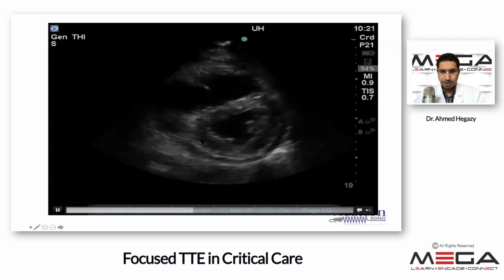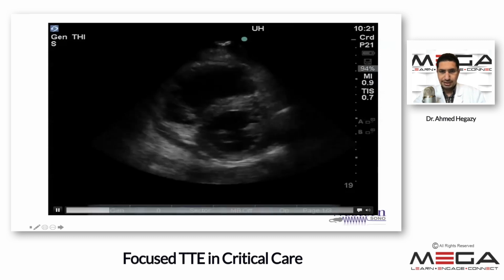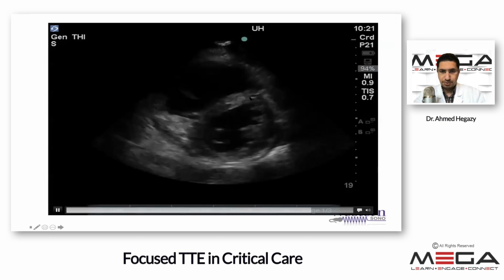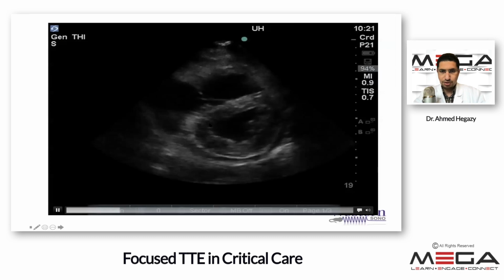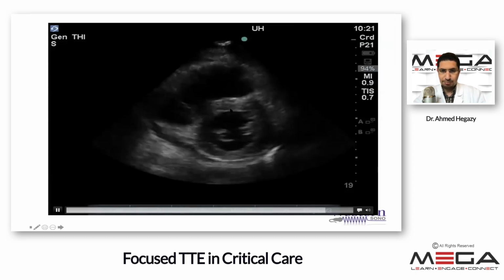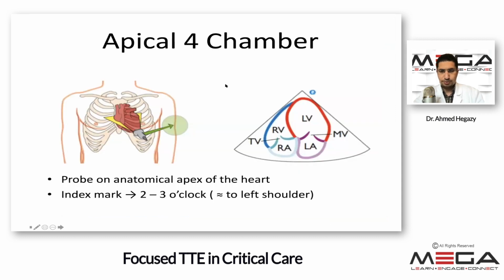And there's another application for the parasternal short axis. We mentioned that the ventricle normally looks like a D shape, an O shape, I apologize. It looks like an O shape. Here the septum is flattened. Here you see that the septum is starting to look like a D. And so a D-shaped left ventricle or a flattened septum, as we've said, indicates right ventricular volume or pressure overload.